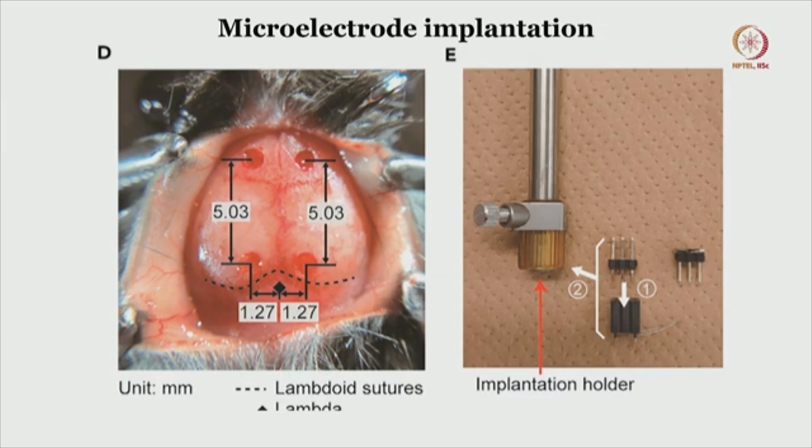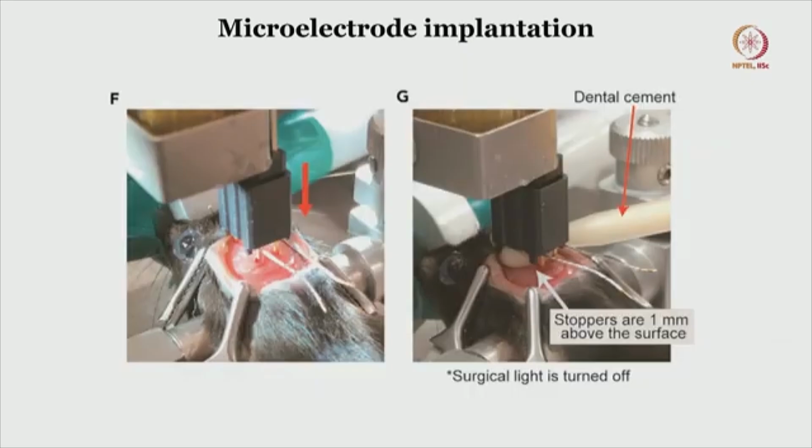Once your burr hole is made and the implant is mounted onto the adapter, you are good to lower it down, alright. This is the zoomed-in view wherein that is the adapter holding the implant, and you can see the electrodes at the tip of this particular implant. There are EMG wires as well. Those electrode tips are going to record the electrocorticographic signals from the surface.